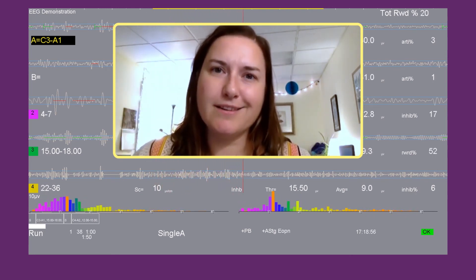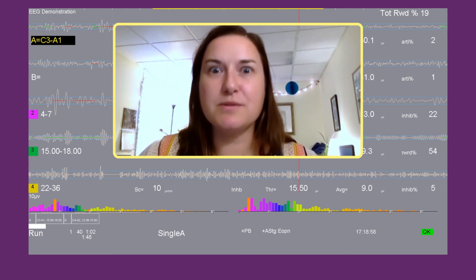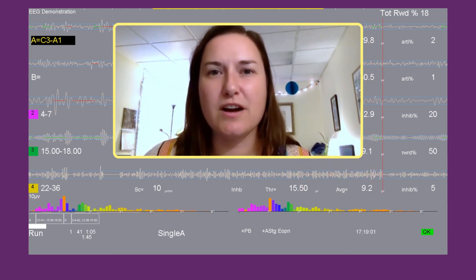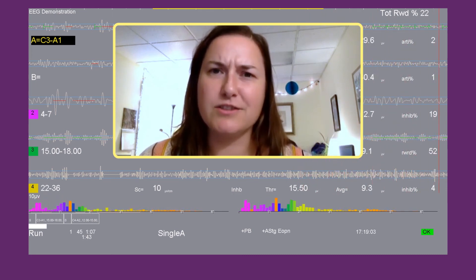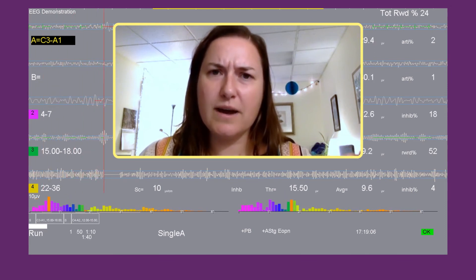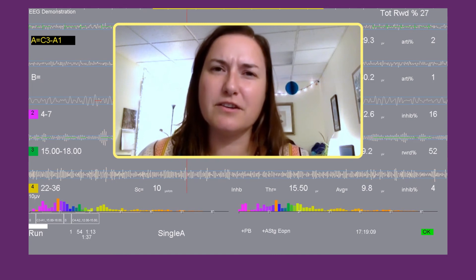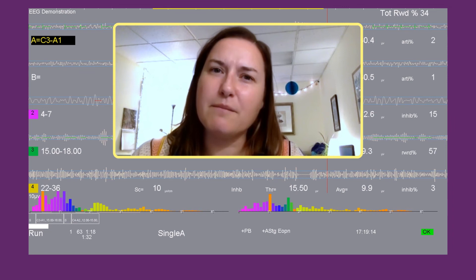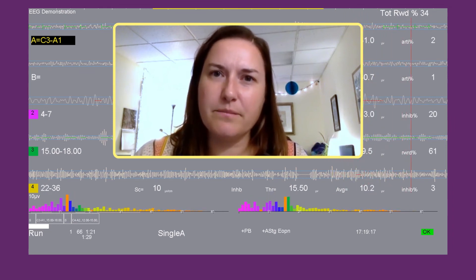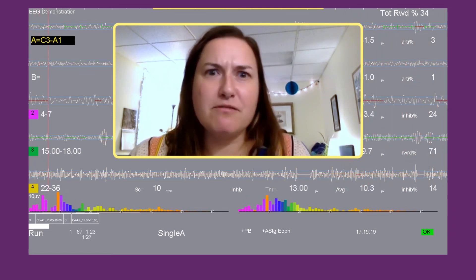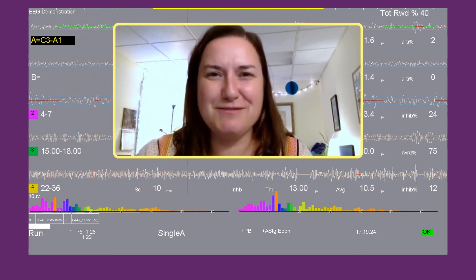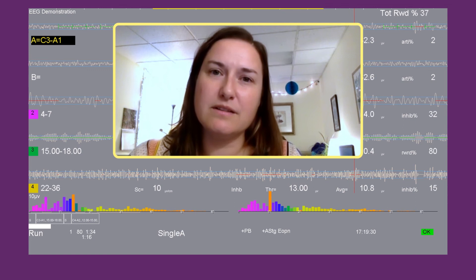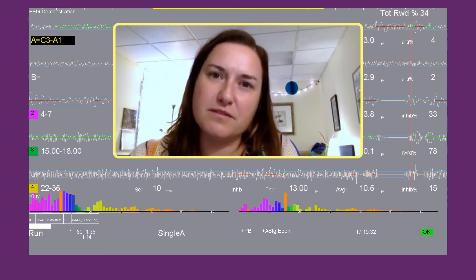So while you're waiting for the screen to initialize — as it's kind of scrolling across — you look down at the spectral and you see: oh, the quietest, the smallest orange bar is actually flickering at 11. So if I have my reward band set to 12 to 15, I'm not including the weakest frequency. And if I am an over-arousal person, I might want to have a little bit more 11-hertz frequency in my life.